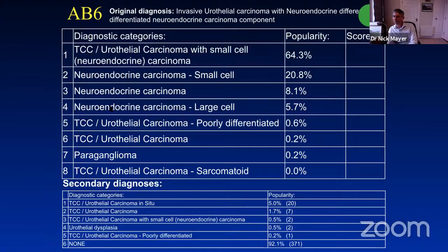So if we move on, John, are there any comments about that? There was just one comment. Just I'm not quite sure how I could say this. So isn't correct any small cell component makes it small cell carcinoma?